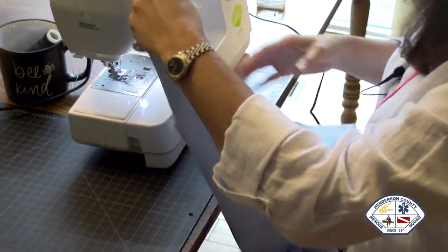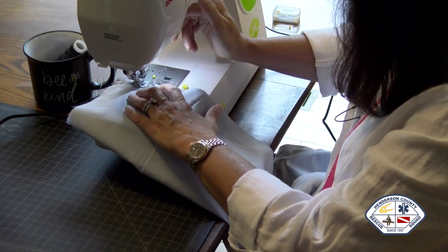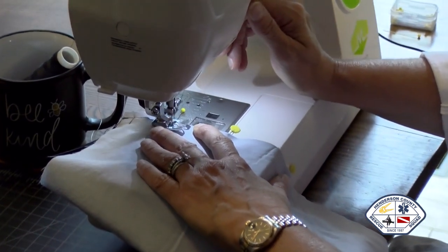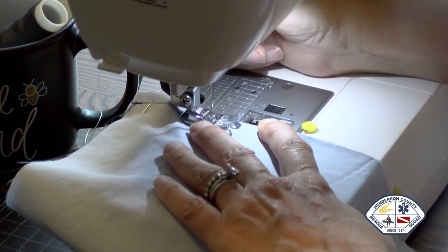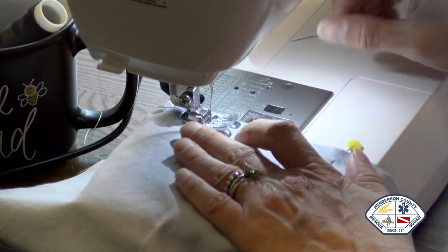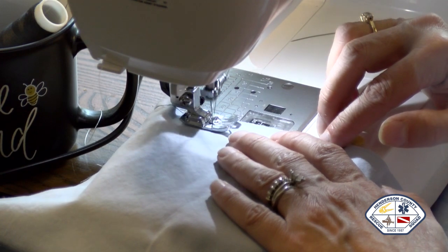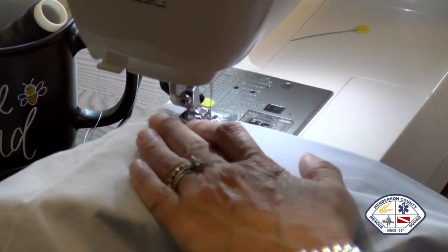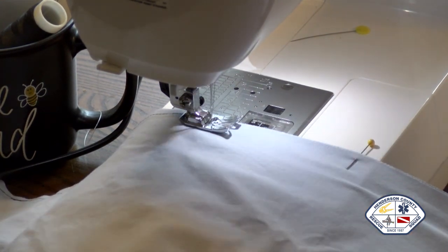So we're going to sew 2 inches and then leave a hole. Okay, let's see. Let's knot our fabric real well. And now this is also a place that is going to need a little bit of extra stitch just because it's going to get pulled quite a bit. So now we're going to leave our hole, move up to that next pin, which is 2 inches away. Go back again. There, perfect. And we're going to extend on up. Oh, this new sewing machine, I just love that it automatically backs up on me. We're going to head on up to that shoulder seam. Zoop on up.